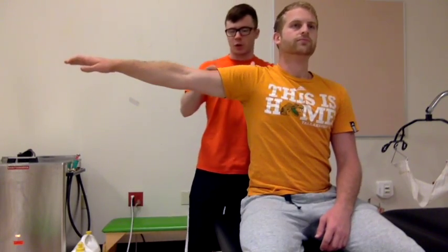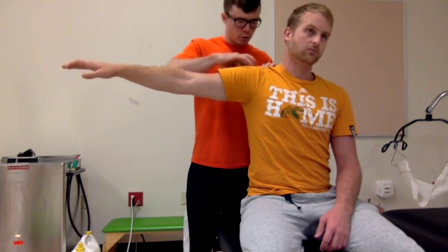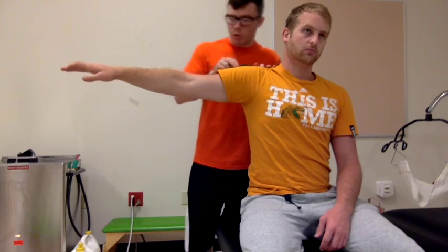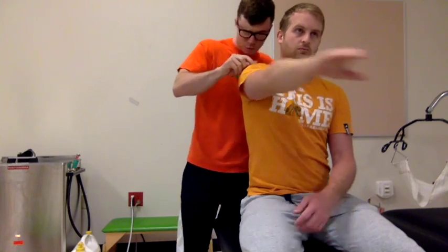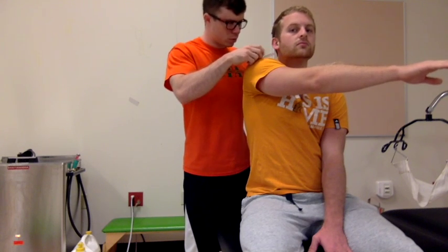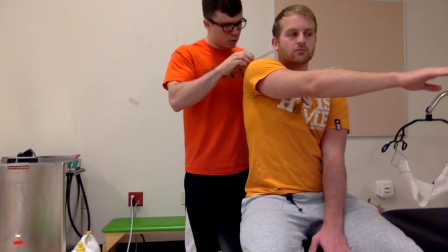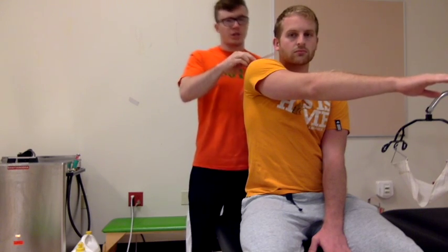Next up, we have horizontal adduction. The pivot is going to be at the glenohumeral head, which is at the acromion process. Perform the movement for me. Distal arm lined up with the lateral epicondyle, parallel with the trunk, looking at about 110 degrees.